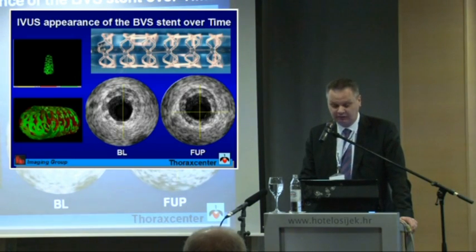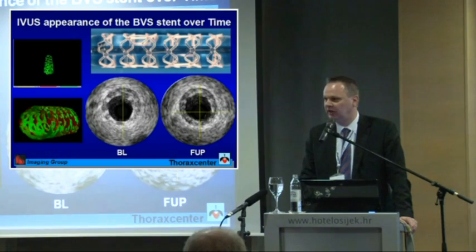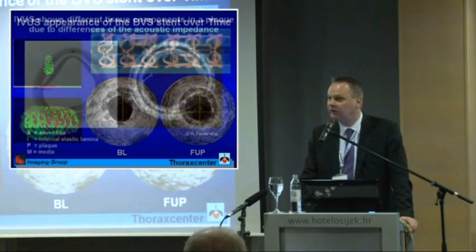However, if you look with intravascular ultrasound, you can see that post-implantation there are bright spots which identify the stent struts. And 6 months later, those bright spots are less bright, less echogenic. And that is something we can measure.